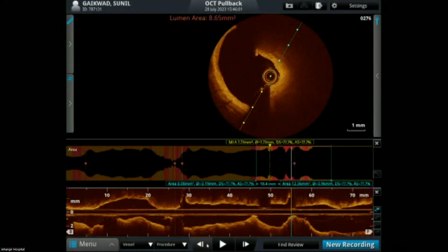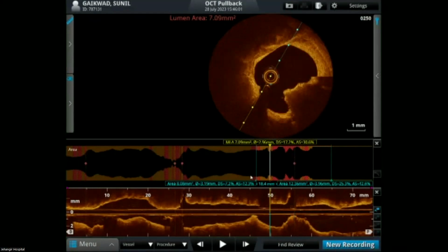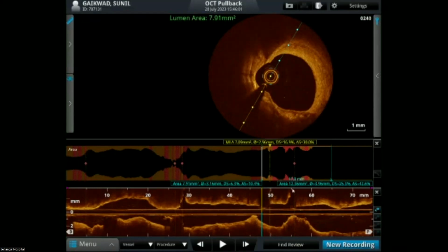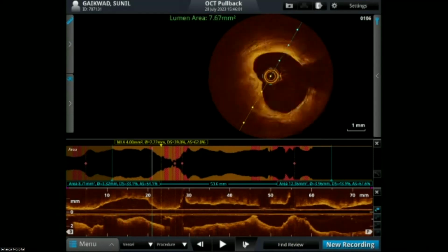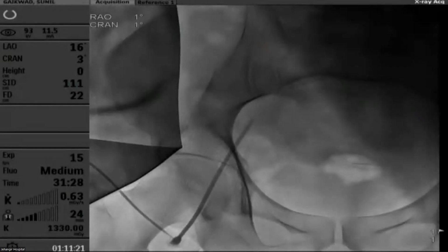Rotation, then lithotripsy, is a very good modality here, but the only question is that the distal lesion we won't be able to do. Proximal we could have done very well with orbital, but distal, if you see the first angio, is almost 100% occluded with calcium. So keeping that in mind, rotational atherectomy would probably be a better choice. Yes, orbital for proximal we could have done, and here we could have done it with 1 burr instead of escalating to 2 burrs. Orbital atherectomy, 1 burr, for all the artery size, we could have done, but distal crossing would be impossible.